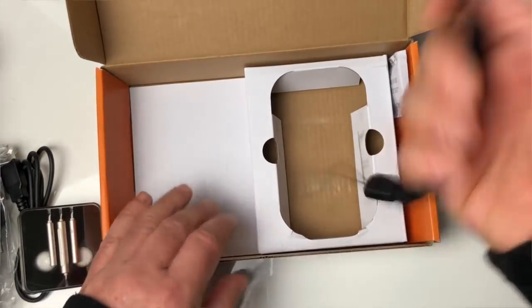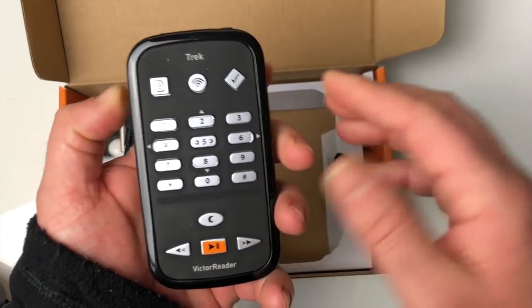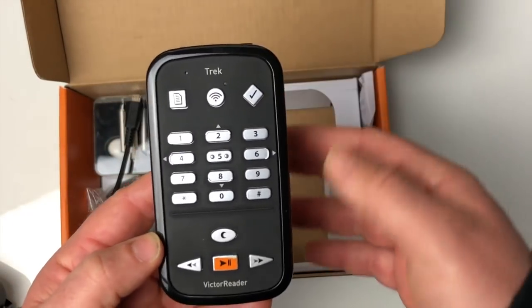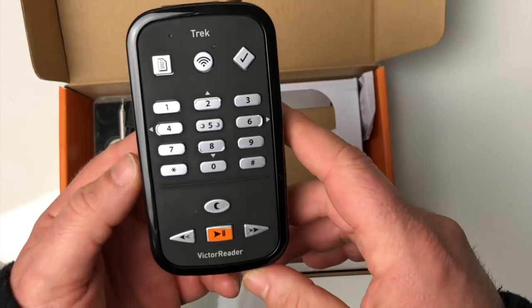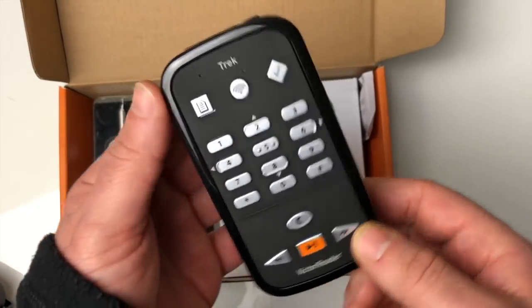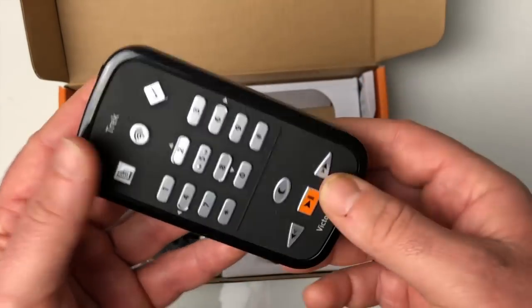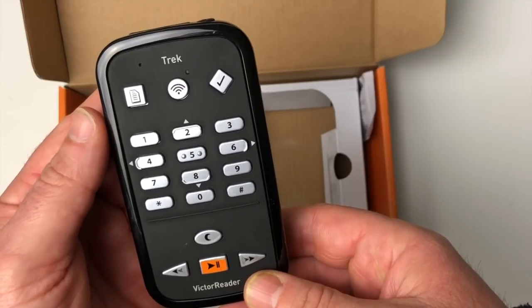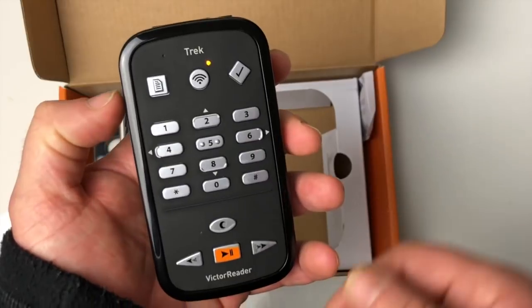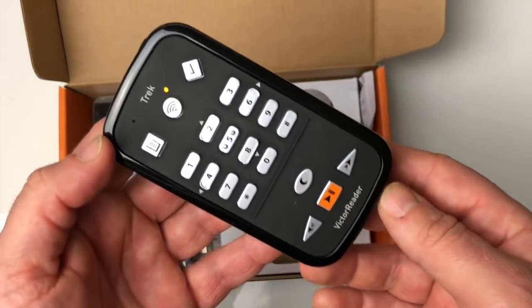Si on allume l'appareil, au premier allumage on sent une petite vibration qui nous dit que l'appareil est en cours d'allumage. Un petit détail bien sympa — étant donné qu'il a vibré, on sait que notre appareil est actif. L'appareil annonce : « Bienvenue à Victor Reader », orientation, volume extérieur 5. Il indique ensuite : « Recherche de satellites en cours » et « Connecté au réseau WiFi ».